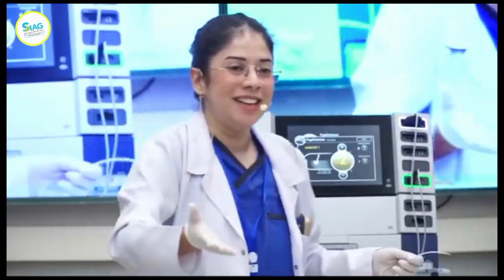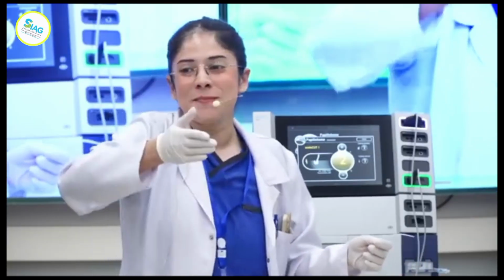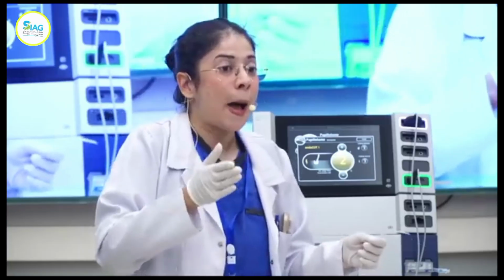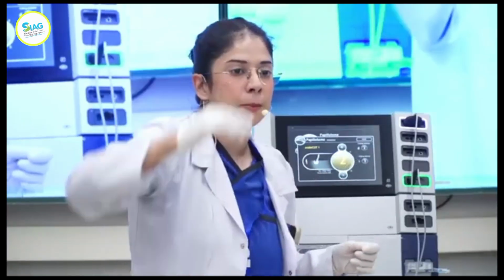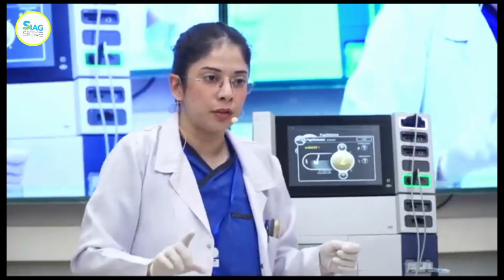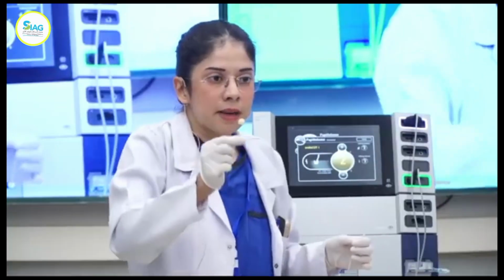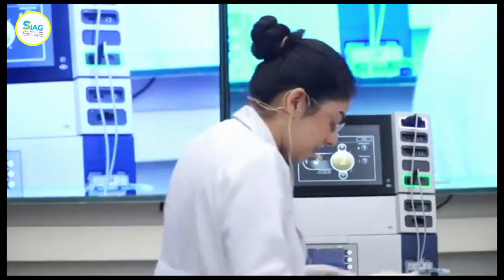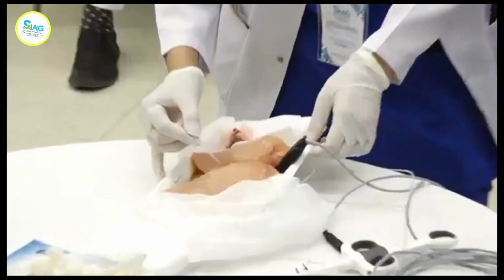It depends on expertise. If you get a continuous slice, as a trainee, if I use pure cut in the first go, I might not have such fine control over my sphincterotome, and I might end up creating a zipper cut. Zipper cut with perforation. But pure cuts do not increase the chance of bleed. They're very good currents to use for sphincterotomy. But I like endocut because it gives me a little bit of a pause, and I can reevaluate in those few seconds, milliseconds, if the axis is correct, if I want to take a pause. I will not do this. A lot of us do this.